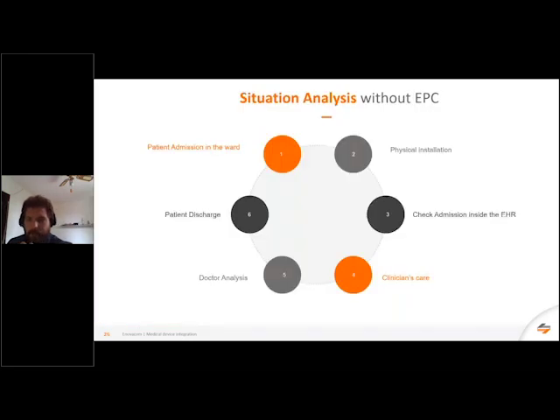Let's see the situation now. To resume the main point of patient care, the patient arrives. Sarah would check details about the patient, reading his record, and then she will assume the patient's monitoring. She will regularly watch for him and report vitals inside the EHR. The report is done manually and is crucial for the doctor in charge of Sarah's patient. Thanks to those vitals, he will be able to make the best decision to adapt the treatment in order to maintain or improve the health of the patient. If vitals are reported at the right time, the care can be improved.